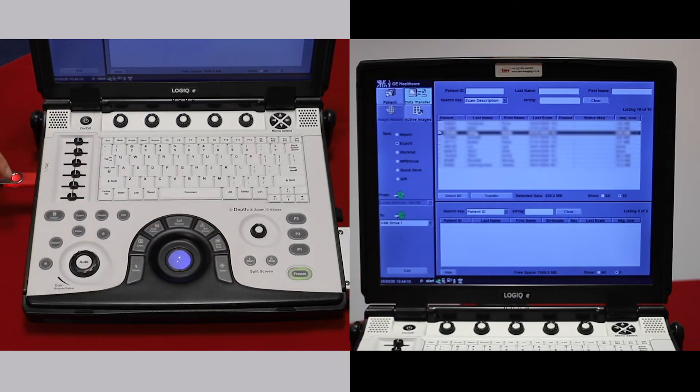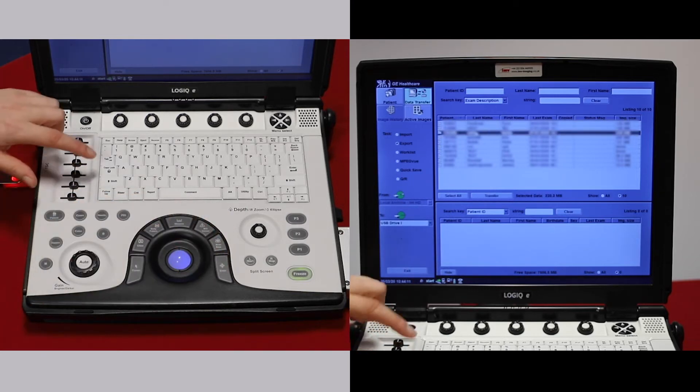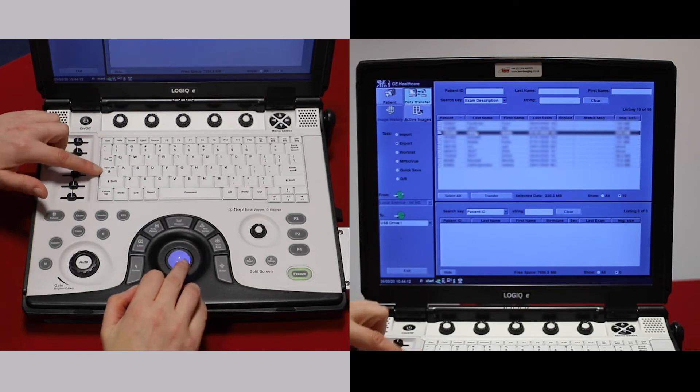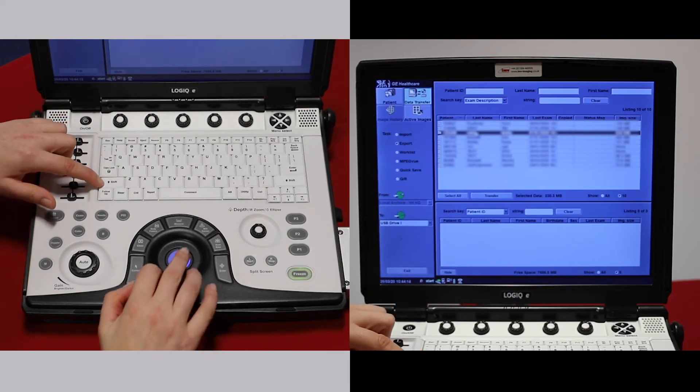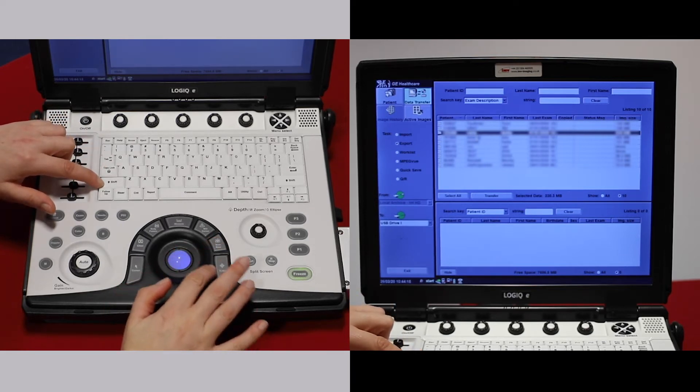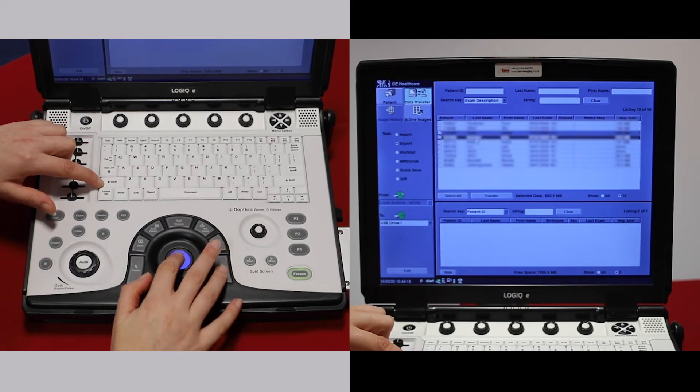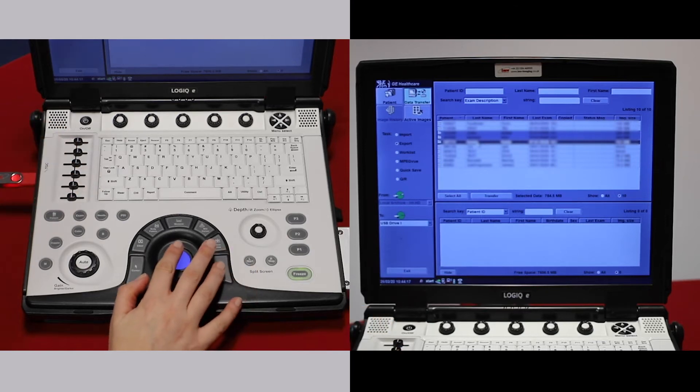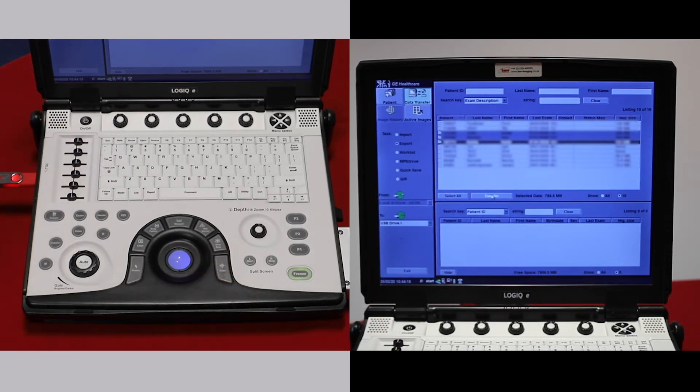You can hold down CTRL or SHIFT to select a few. Then transfer.